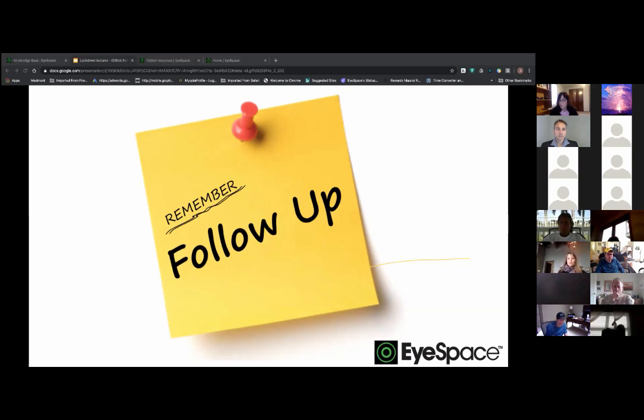Yeah, and just to add to that, Daren, just keep in mind when your patient is sitting at the slit lamp, most of them will have a slightly unnatural posture. They'll sit a bit more forward. You've got this exceptionally bright light in the eye. You've just instilled fluorescein. It's a foreign substance. Most patients will not be in a comfortable state at this point.